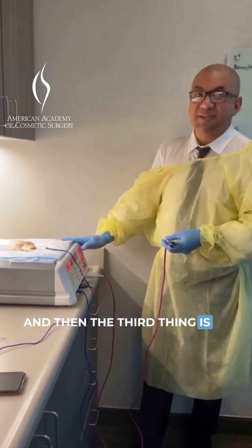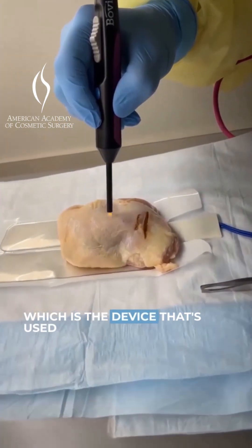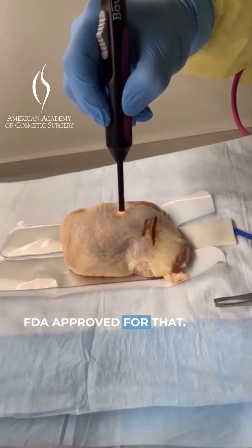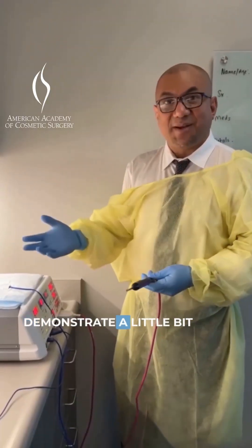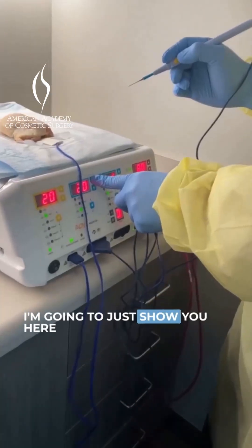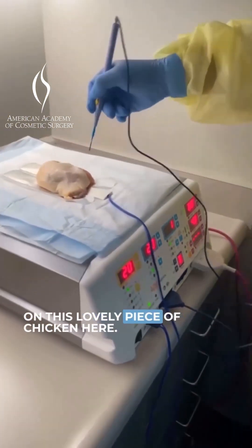And then the third thing is J-Plasma, which is the device used for cutting and coagulation — FDA approved for that. So I just wanted to demonstrate a little bit how it works. Here's a classic handheld pencil. I'm going to show you here on this lovely piece of chicken.